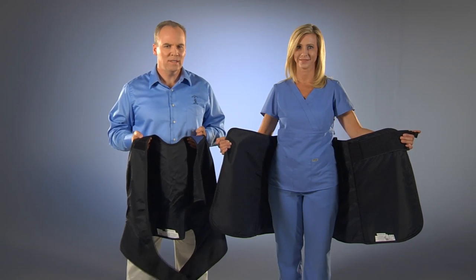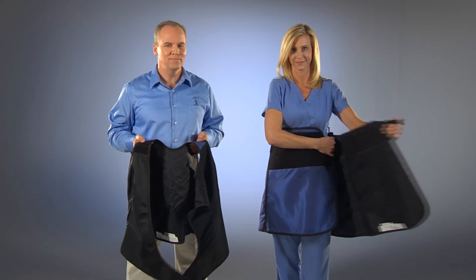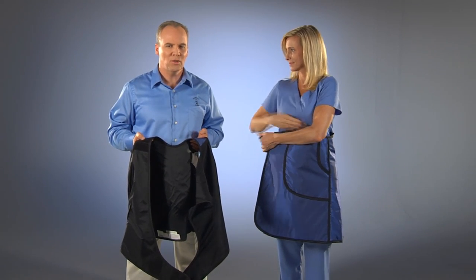Now we are going to go over how to put on and properly wear the PVK. Just stand holding the kilt behind you. Close the left over the right. Wear the kilt where it is comfortable for you.